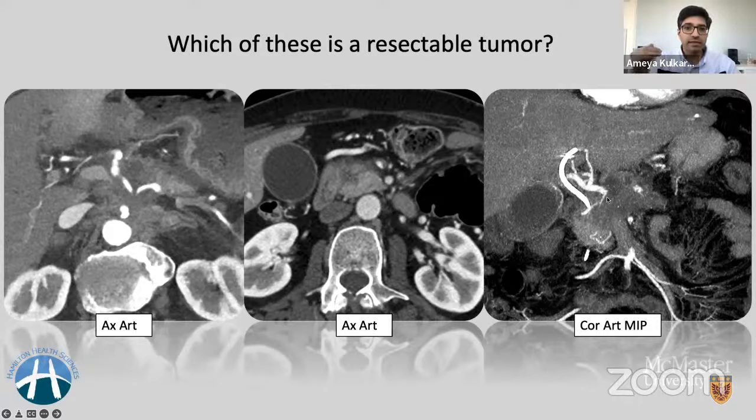So you have to dissect this case further to make sure that you rule out all the red flags which will prevent this patient from getting surgery.